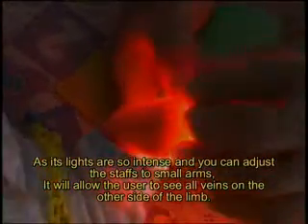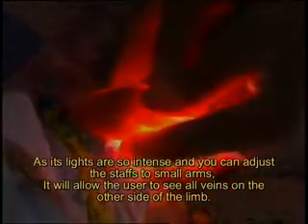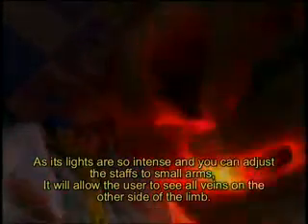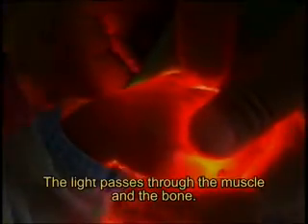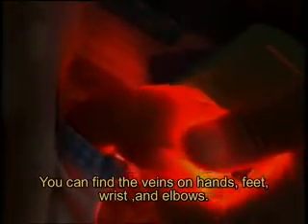We use this method for children less than 2 kg. It allows the user to see all the veins on the opposite side of the limb. You can use this technique on hands, feet, wrists, and elbows.